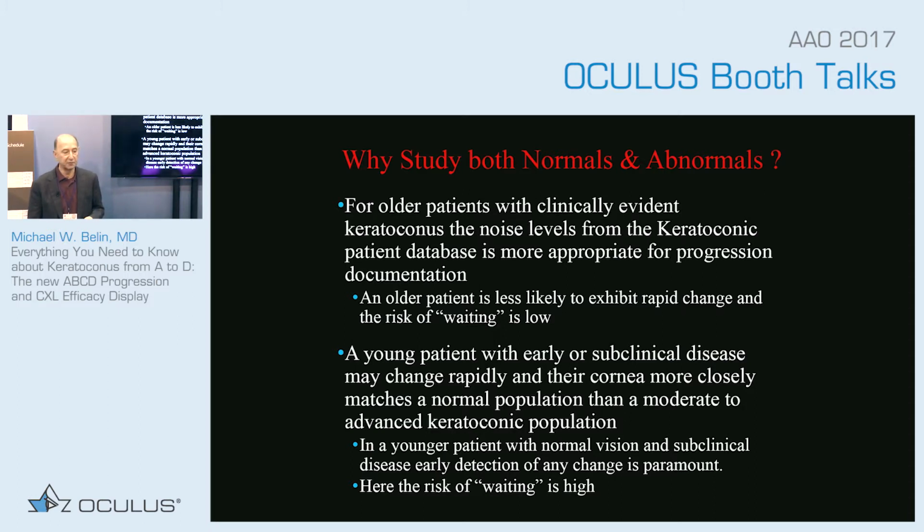A normal database for those with very early disease or those patients at higher risk, someone very young, and a keratoconic database for the patient that may be older with more established disease.